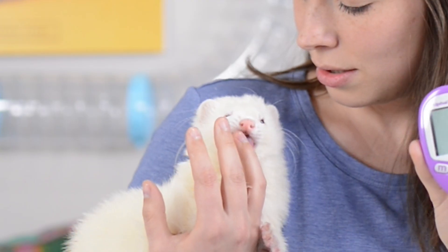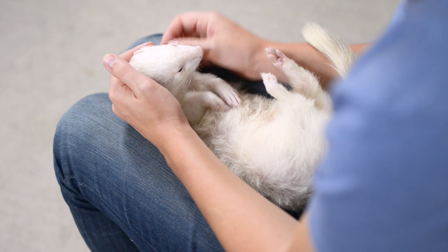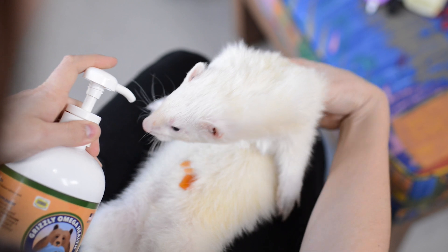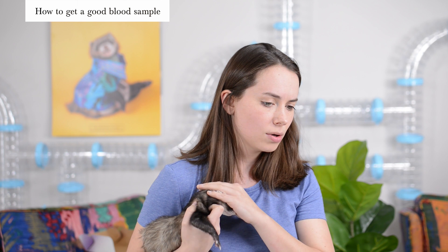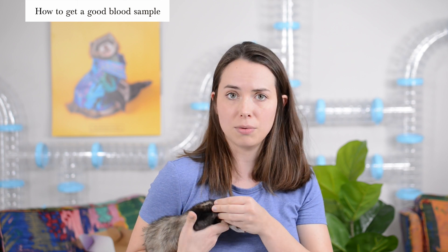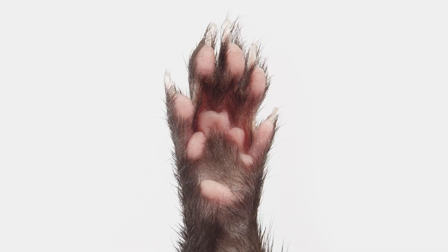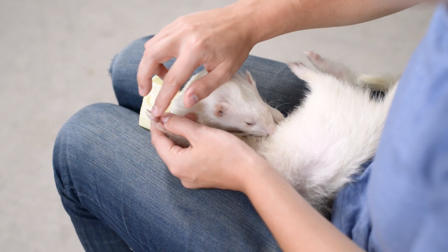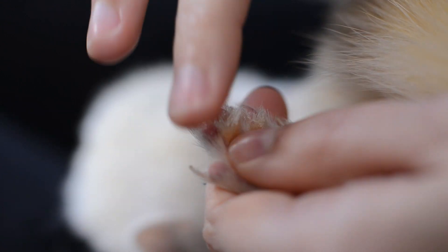Position your ferret in your lap, belly up, feet towards you. Squirt a little bit of salmon oil on their belly just like you do when clipping their nails — it should distract them for the next one to two minutes. Select a paw and choose a toe that doesn't have a lot of fur around it. Try to prick the middle of the toe so that when the blood comes out it doesn't get matted in the fur. This is a tip from our vet: apply a little bit of Vaseline to the test site to help the blood droplet form and keep the fur away.